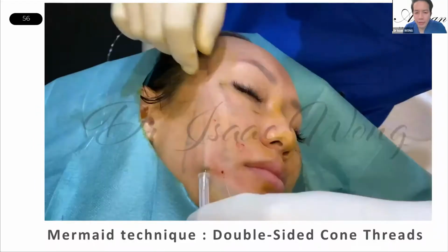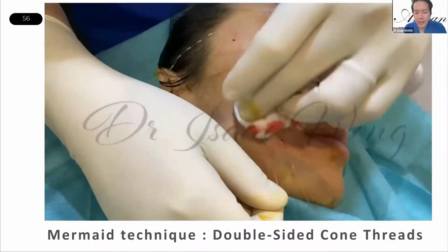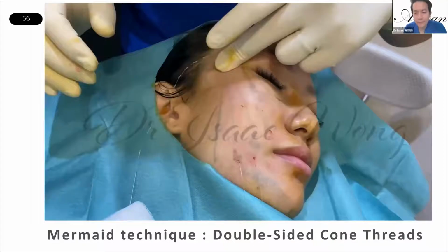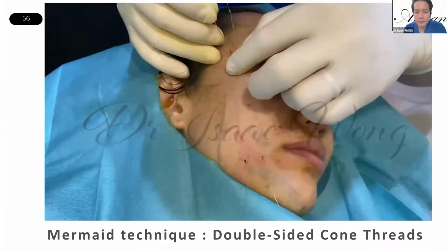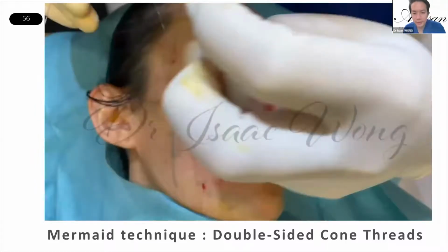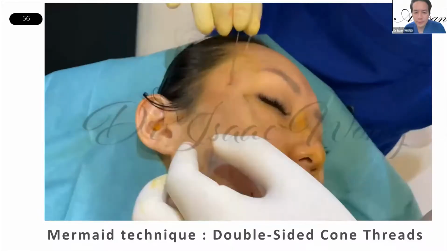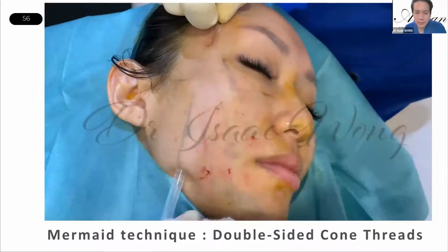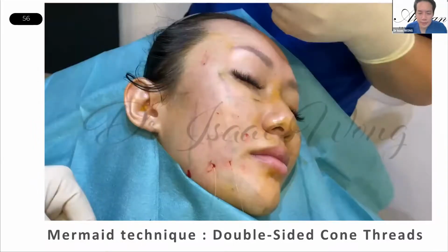Okay, so you can try this. If you put it in layer 2, you will not get such an effect. You know that you are in the right planes if you actually get an instant result like this. Okay, deep, superficial, and hook it at the end. And drape it. Nice.